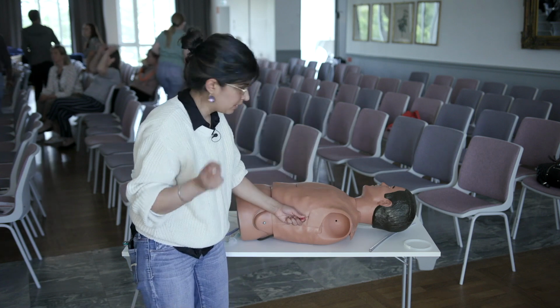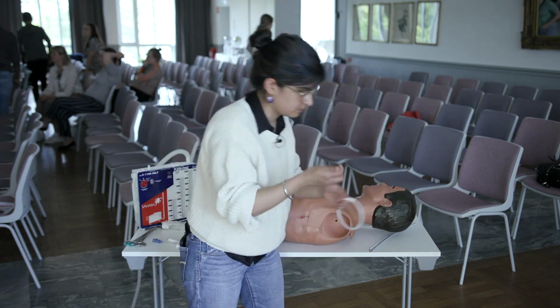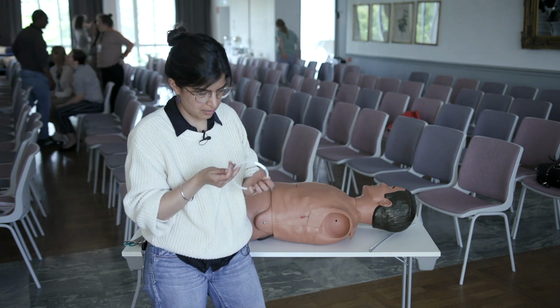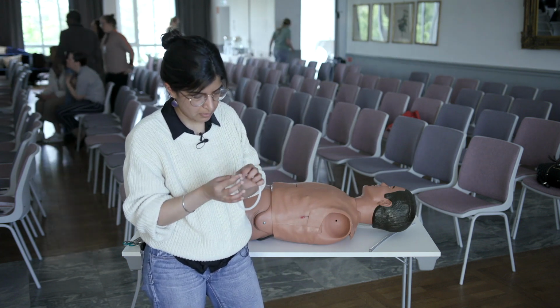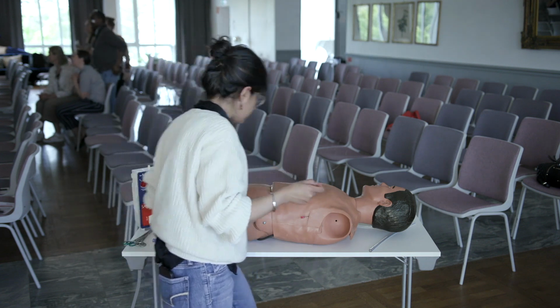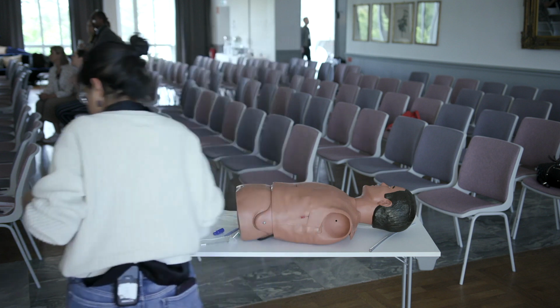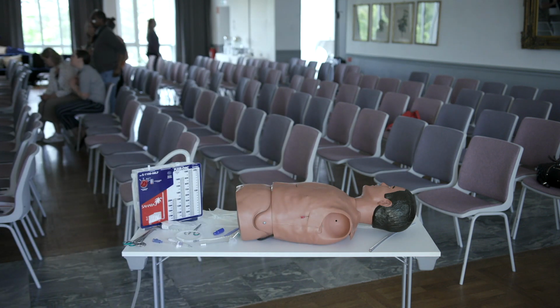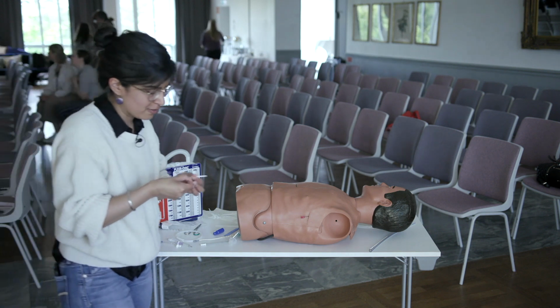Find your wire. Now this typically comes loaded in some way, like this, in a coil. And then you have the straightener piece, which is right here. Anyone actually know what this is called? I have no idea. I've never been able to figure this out.